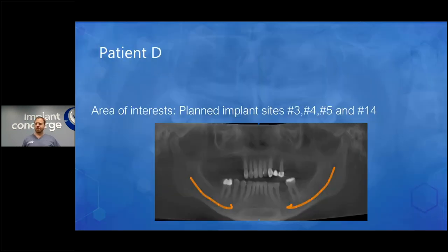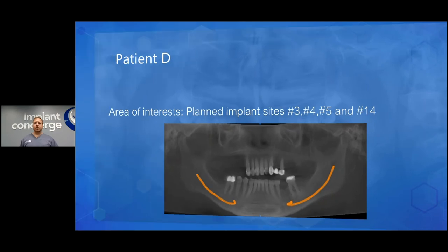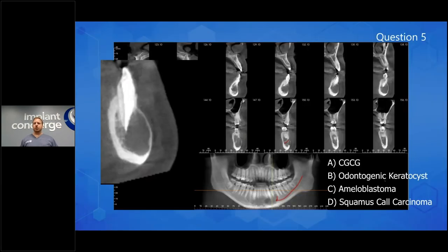We have a question asking exactly how old that patient was. Well, you're just looking, they have their third molars, so you're in your 20s. I'm going to say between 20 and 30. I don't have the exact answer to that, but I can look that up and add it to another presentation.